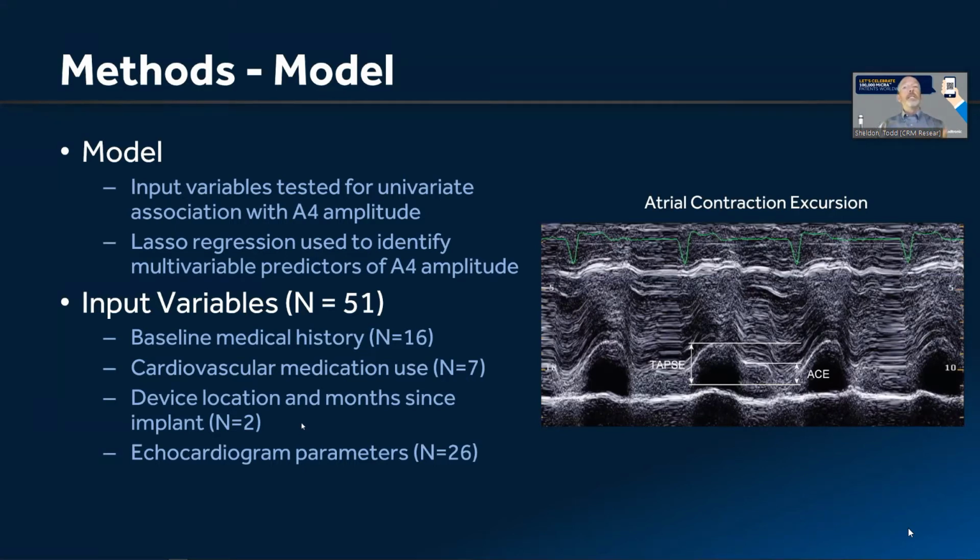In all our studies, we were downloading this algorithm into patients just for a brief amount of time. But some of the patients had been implanted yesterday, and some had been implanted 5 years ago. So we had a good distribution of how long the people had been implanted, and that was good for understanding how the accelerometer signal might evolve over time.